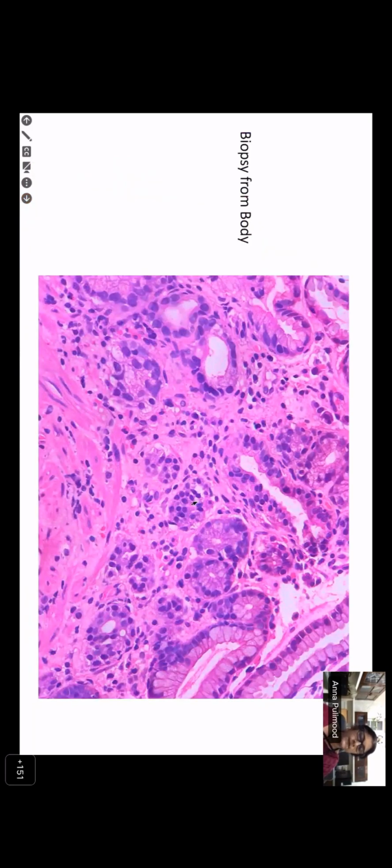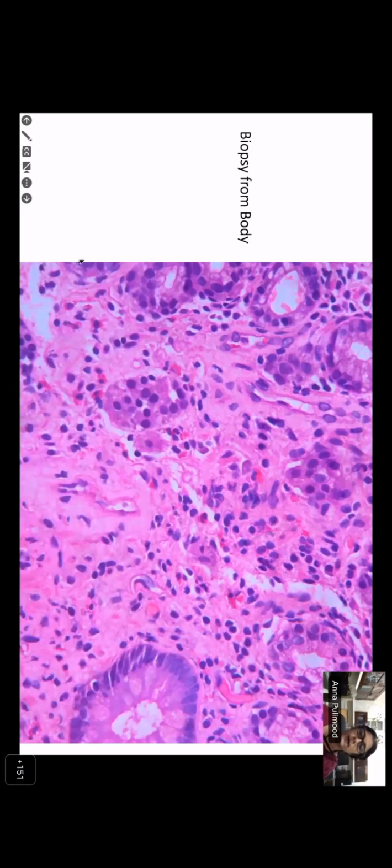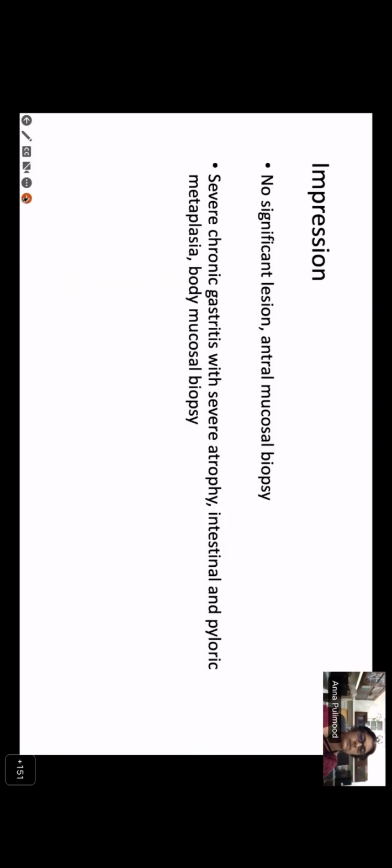Okay, do these remind you of some other kinds of cells? Rahul, in any other lesion in the body, do you get those kind of cells? How are they? Uniform round to oval nuclei, moderate amounts of cytoplasm. I thought these are lymphocytes. Okay, but they have pink cytoplasm, right? And it's forming a nest. Here also it's forming a nest. Okay, let's just go on.